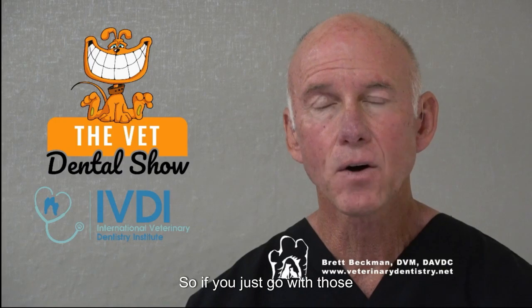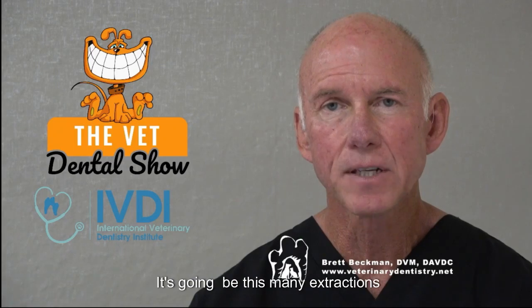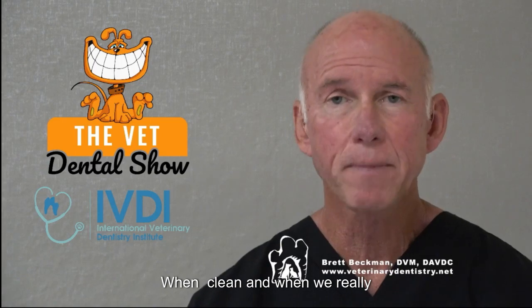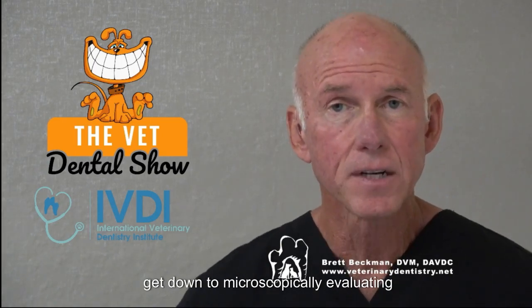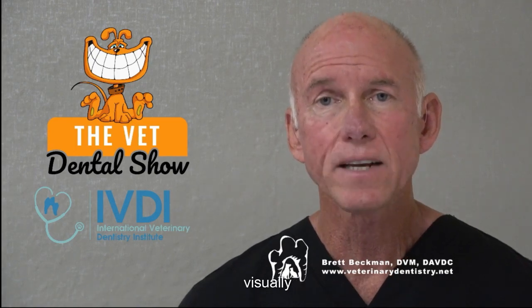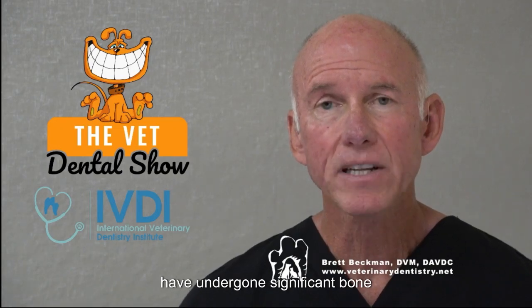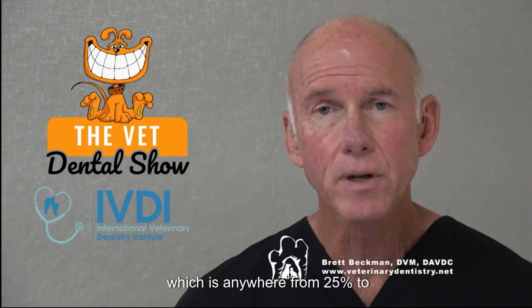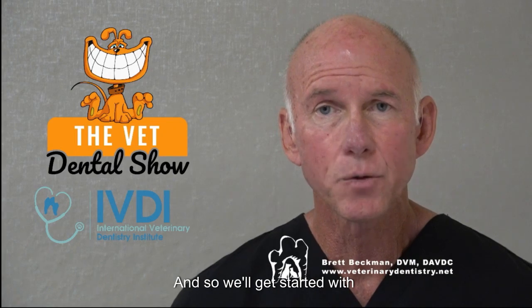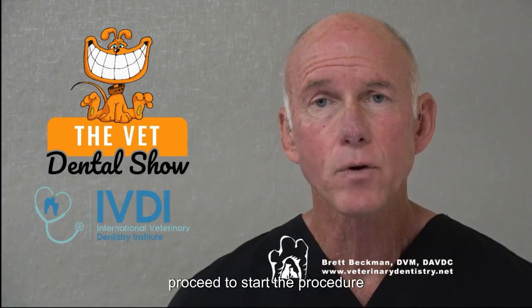So if you just go with those radiographs, you're ready to call the client and give them an estimate. It's going to be this many extractions. We may find some other things when we clean, and when we really get down to microscopically evaluating pockets and evaluating the patient visually. But we know that these teeth have undergone significant bone loss and compromise, which is anywhere from 25% to 100%. And so we'll get started with this, if that's okay. The doctor will proceed to start the procedure.